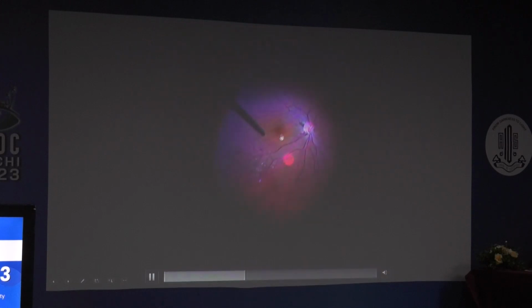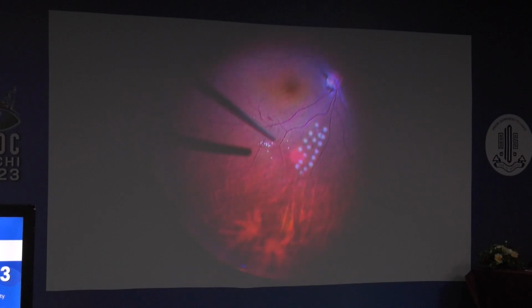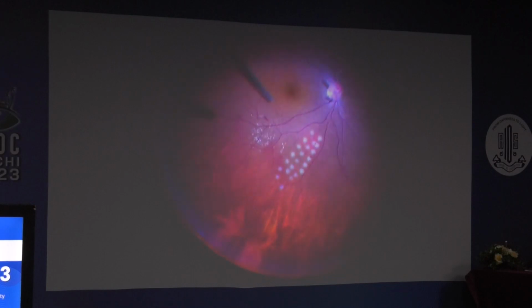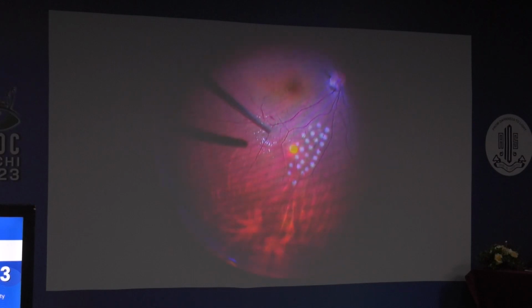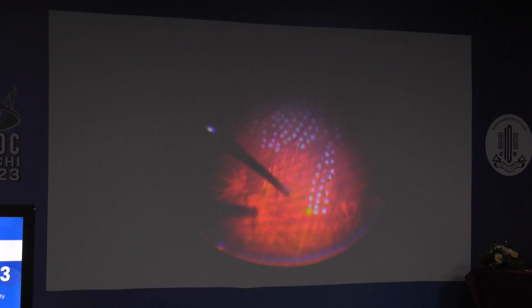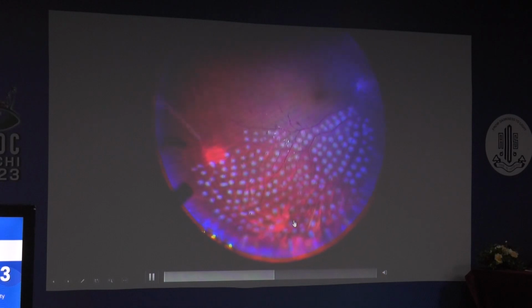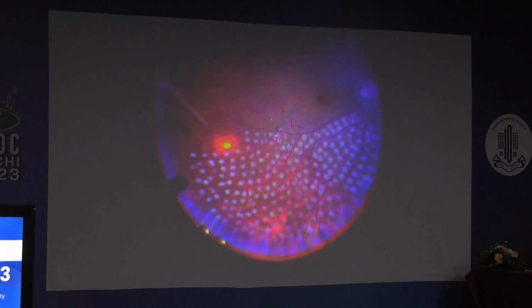The health of the macula and disc you should see immediately. If those two structures are very good, believe me, don't pull too much. And then you have to do laser. Keep lasering. Surgical time in this patient was around 10 minutes or so, but laser took me around 15 minutes or so, because I'm very fond of lasering in a linear fashion, not to have any skip areas anywhere.